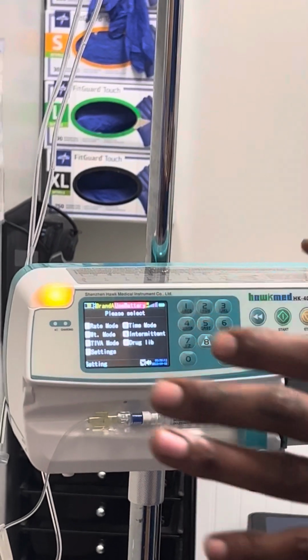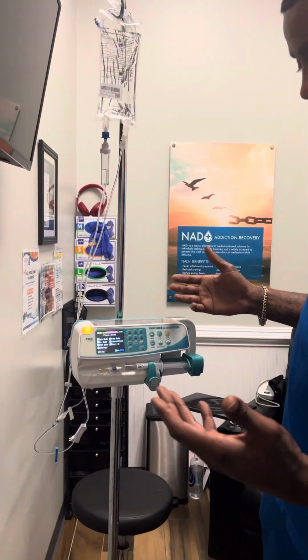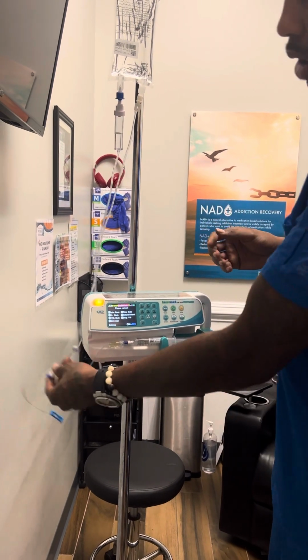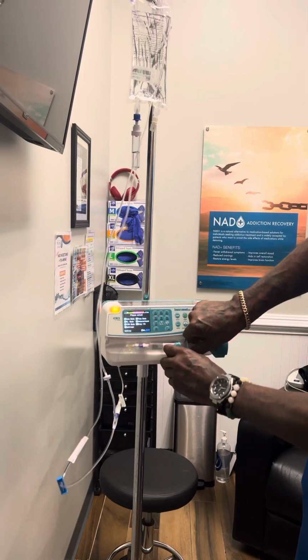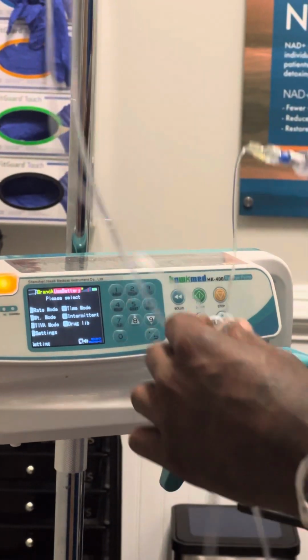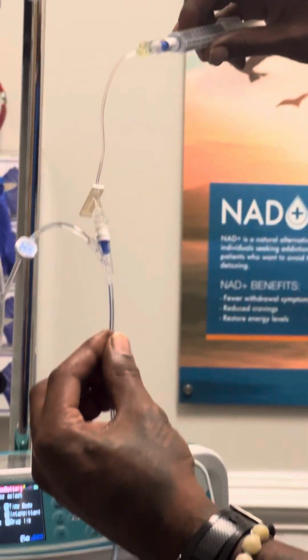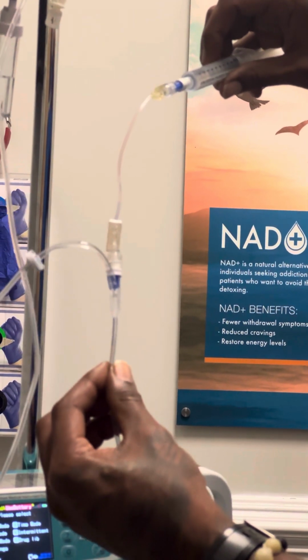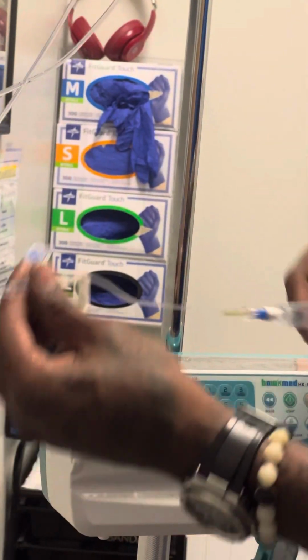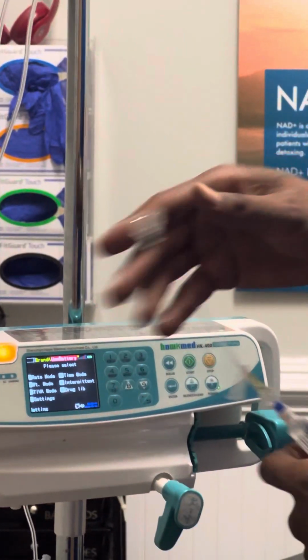So before we get into the pump, we know we're going to have our bag. We're going to have our 1 or 2 syringes that's going to have our 3 nutrients in it, and then also diluted in whatever normal saline that we're using. So the syringe, you can use a 10, you can use a 20, up to a 30, I believe. But we use a basic pigtail that we use for all of our IV connections. And this will go into the port that comes with our tubing that we tap our bag with. So once you have that, you don't have to connect it right away. So you got your bag hanging, you got this connected to your patient.